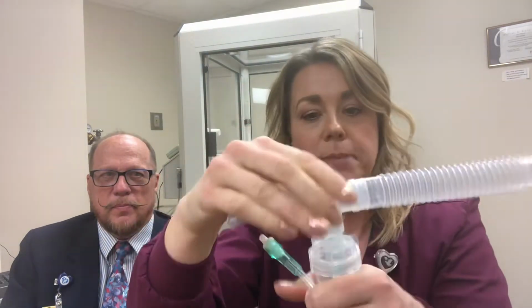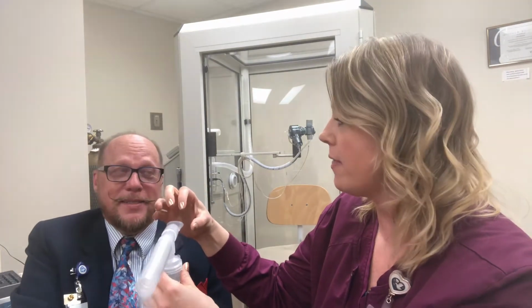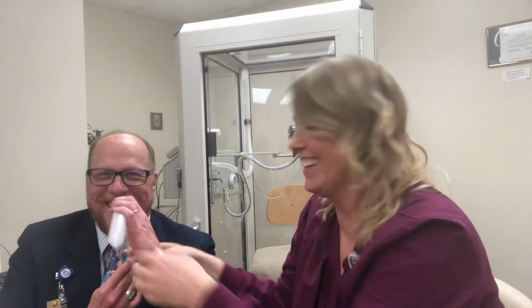And then you put the T-piece back on, and then you can turn the flow meter on, and you instruct the patient, sir, go ahead and put your mouth and teeth, everything on there, and take a nice slow breath in. And then about every couple breaths, we have them take a bigger, deeper breath and really suck it in. And you should see this mist go away when they suck in, and you should see it come out. And then you know they're effectively getting it in.